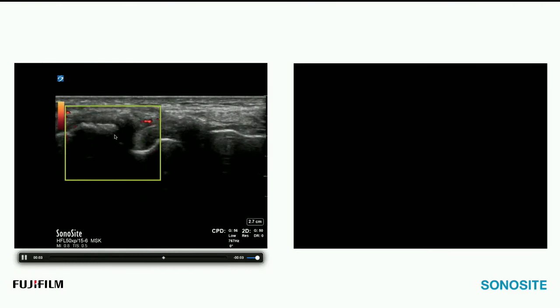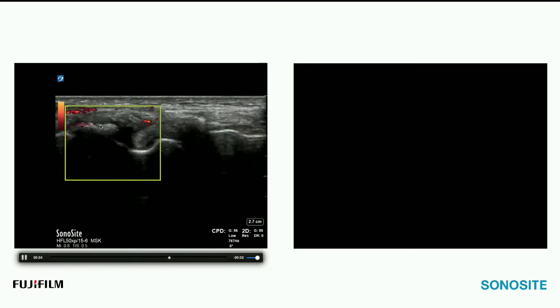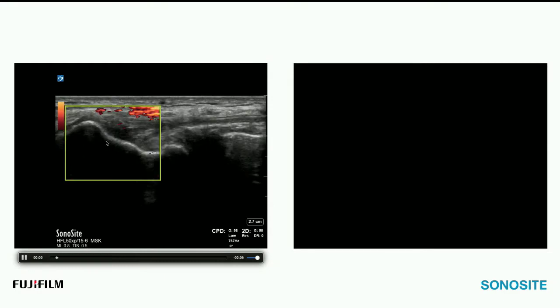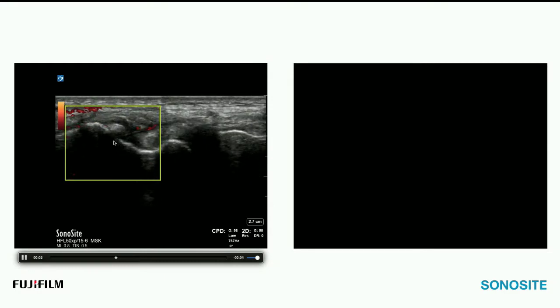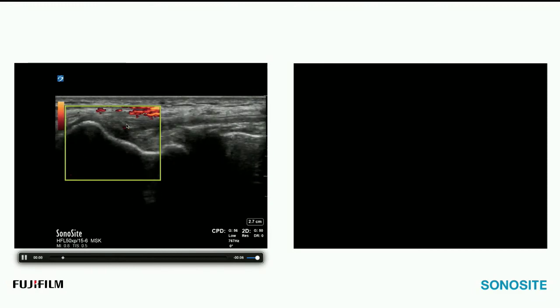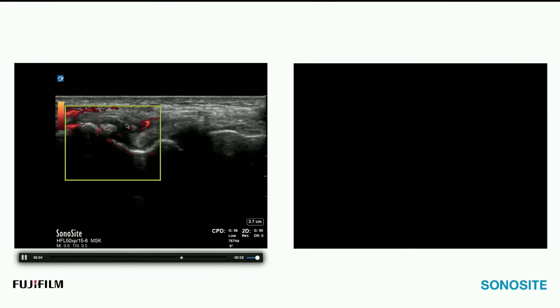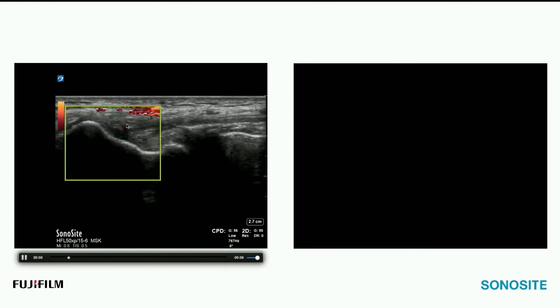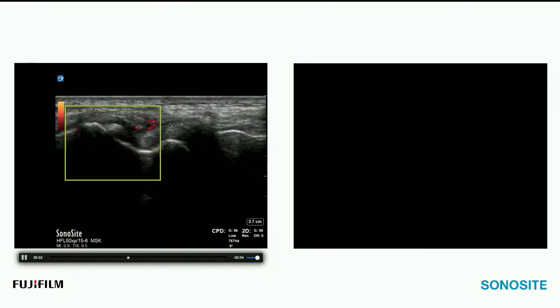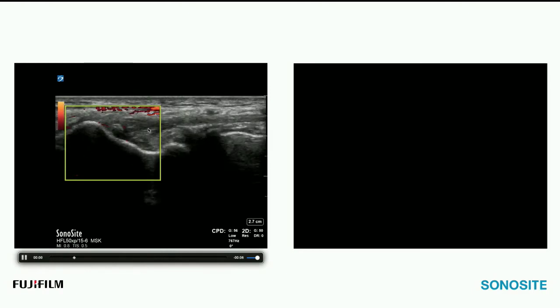We see an old injury in the form of a smooth margined calcium deposit. Okay, so if this looked jagged and I saw some bone irregularity underneath it, I might call it an avulsion. But this is quite old, especially compared to the rest of the patient clinical presentation. This was a very severe osteoarthritic knee. So these are degenerative changes, and possibly some healing still happening within the collateral ligaments of this particular patient.